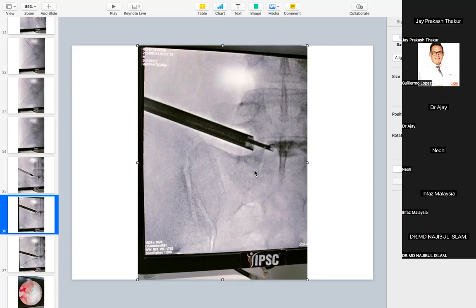So in the L5S1, you have a challenge to go inside. Okay. You can go into the center to the foramen, but beyond that it becomes difficult, because if you try to go more, you will hit the what? What will you hit? The end plates. You are going in this angulation, right? So suppose you are going in this angulation at the L4-5 level, what will happen? You will hit the end plates, right? Yeah. The same, because of this angulation, it's difficult to go more deep inside. Yes, sir. Keep it at the foramen and try to remove it from there.